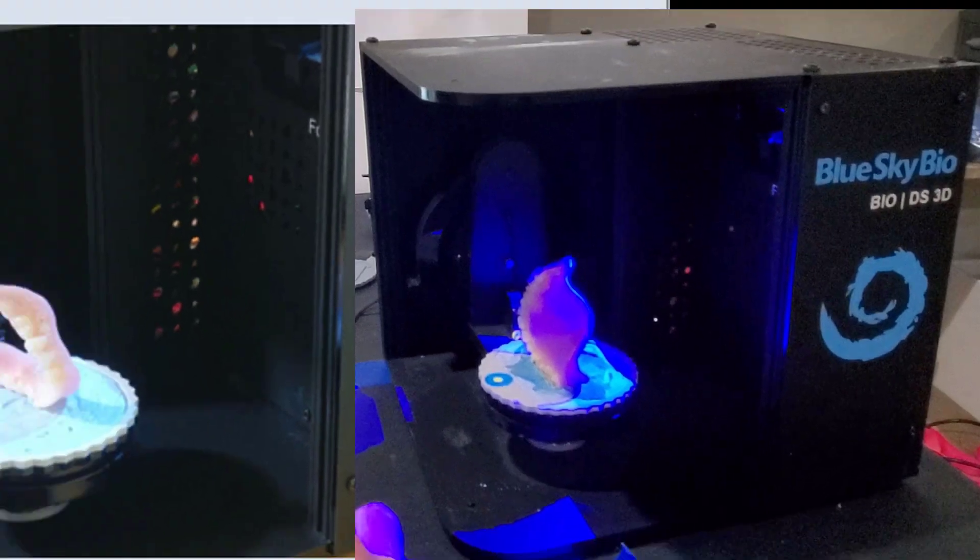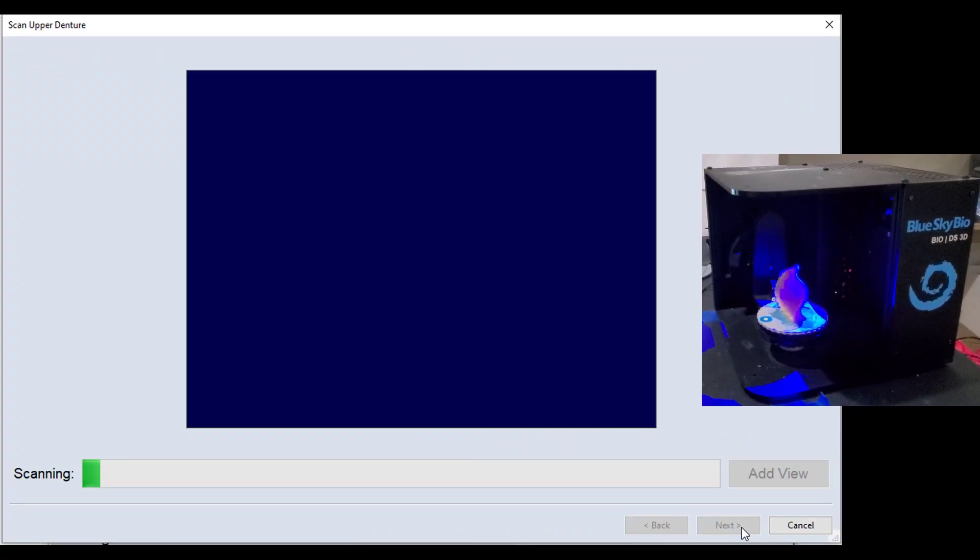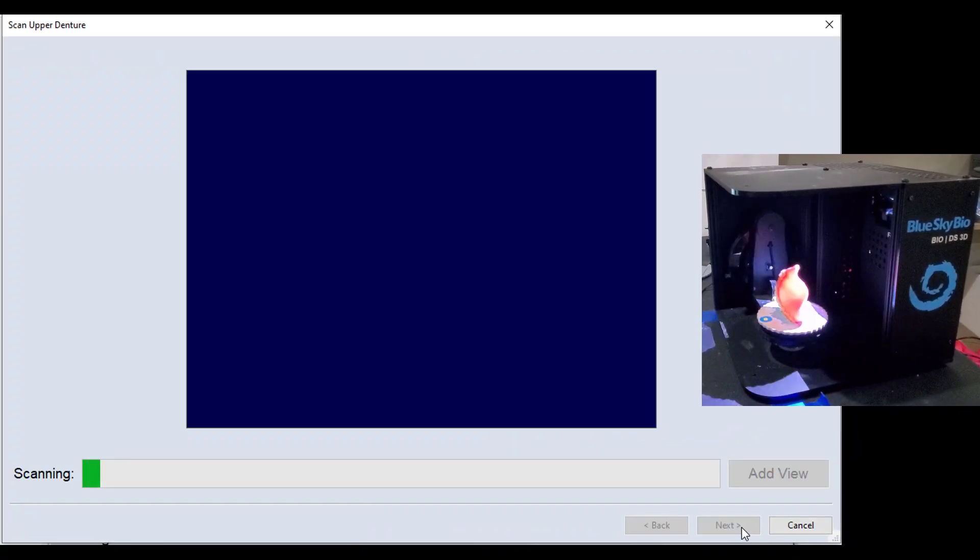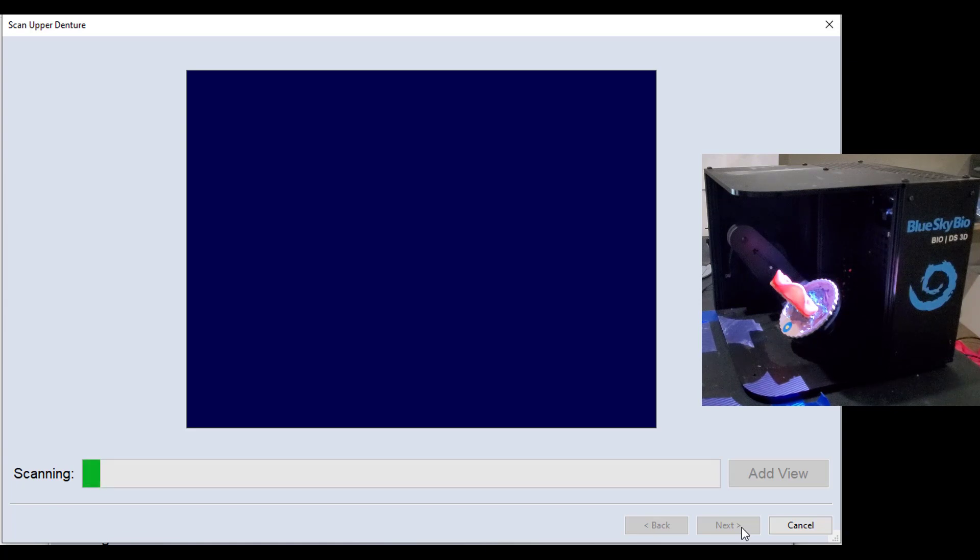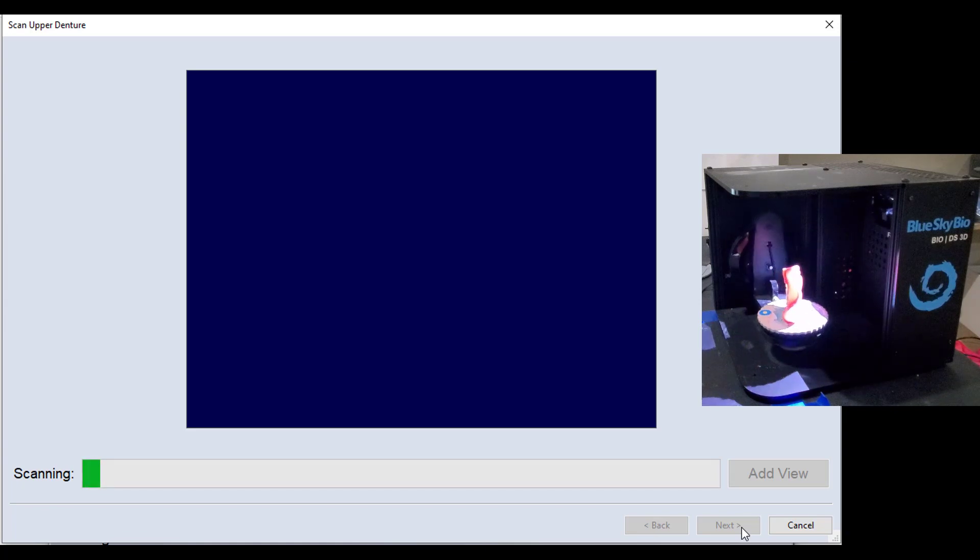And let's go ahead and click next, and the software will now image this. Now one thing I should mention that's unique to this video, this just happens to be a duplicate denture that I have, and it's pretty rough.